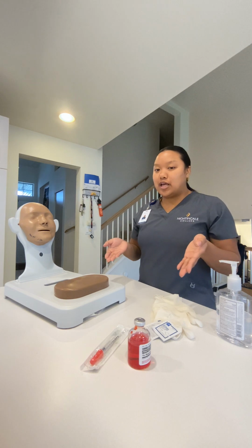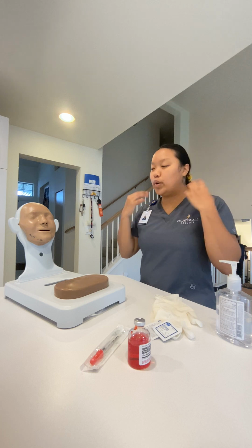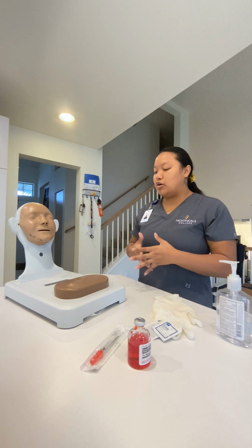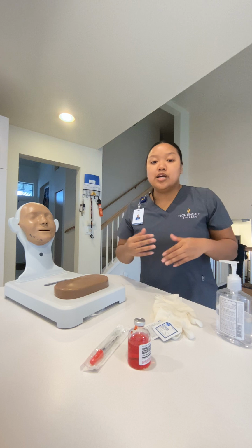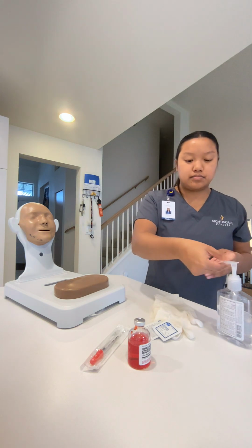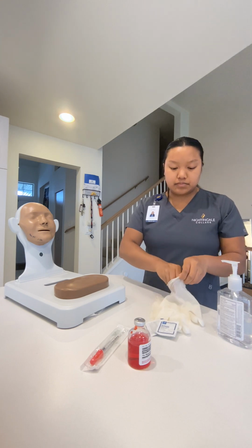Another adverse effect that you might have is if you start getting a really bad rash or you're just so itchy, okay? So especially if you see like swelling of the face, please let me know as well, okay? Does that sound good? All right, do you have any questions for me so far? No? Okay. So now I'm gonna go ahead and get my medication ready. Get my gloves on.